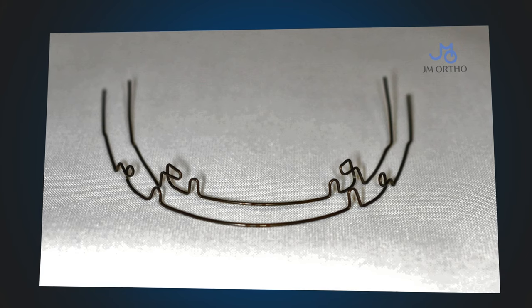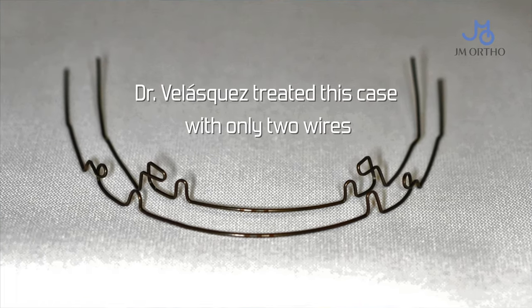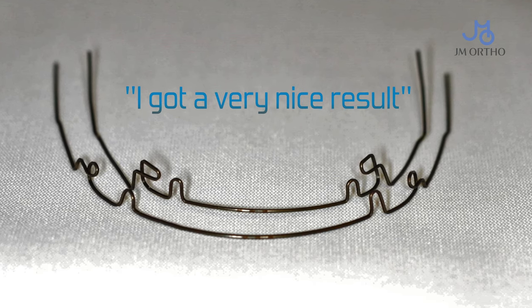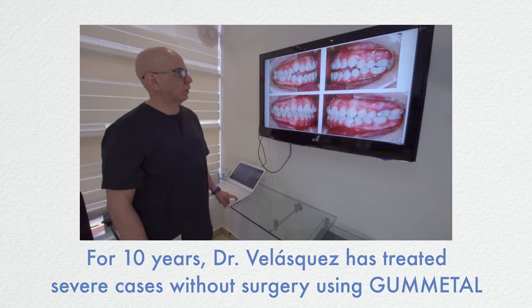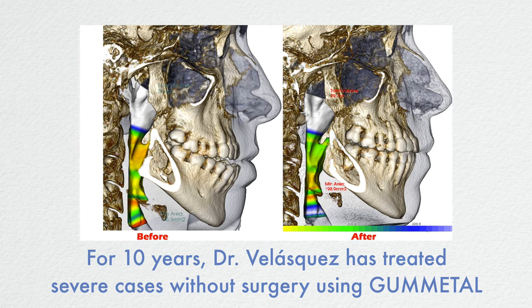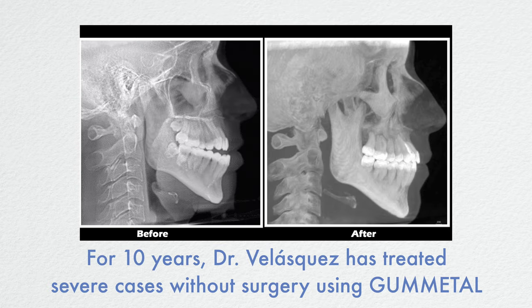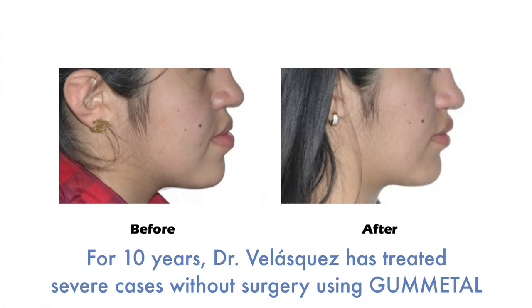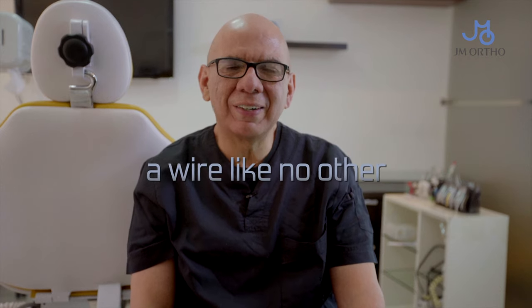Just two wires — that's all. And I got a very nice result. Please try gunmetal. It's a wire like no other.